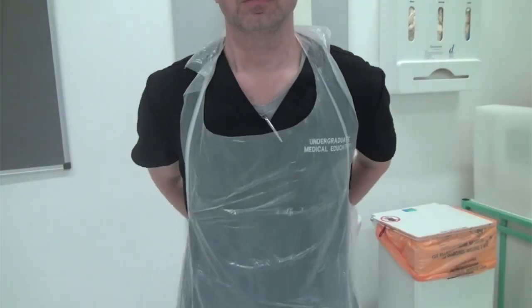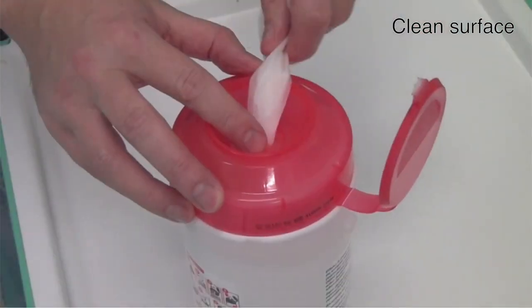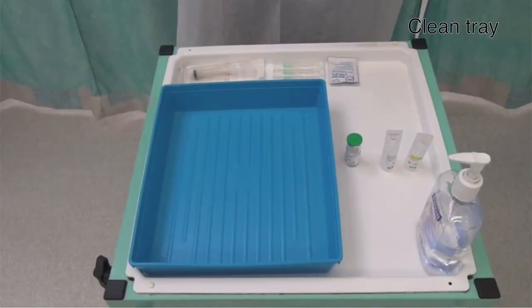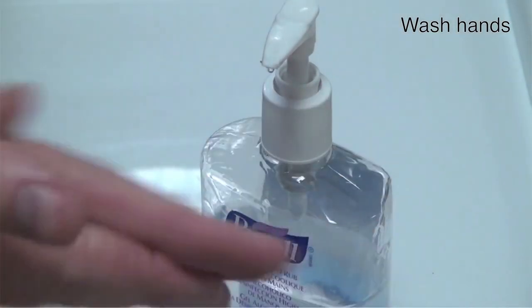Begin by putting on an apron and washing your hands with soap and water. Clean the surface you're going to use and the tray that you're going to place the equipment in — if either are visibly dirty then use soap and water. Gather your equipment together and write out a label. Wash your hands again after cleaning and collecting the equipment.